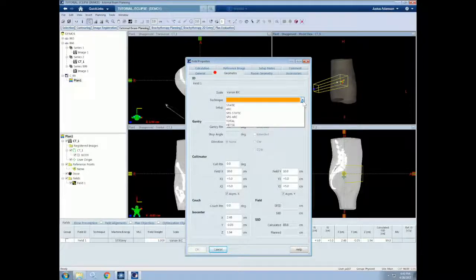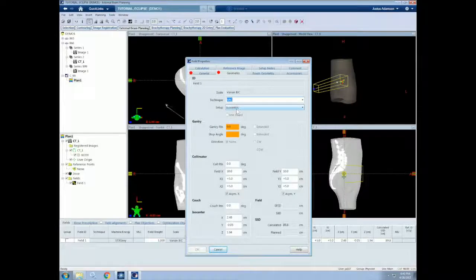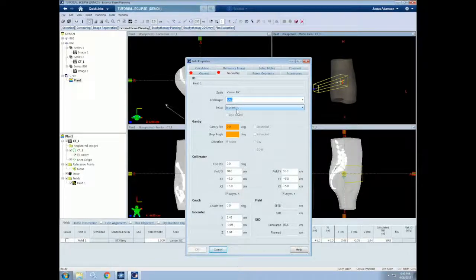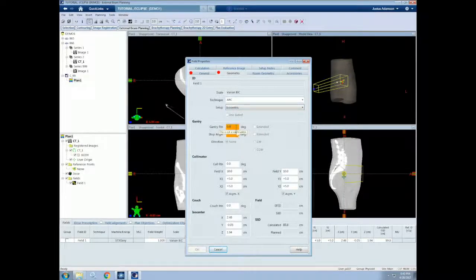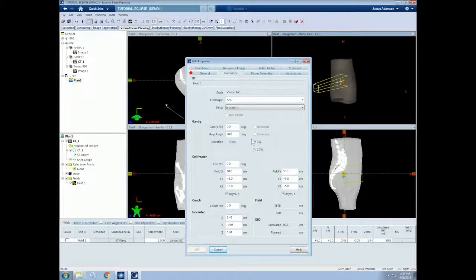Let's choose an arc technique since it requires more inputs. With an arc, we must specify the gantry's rotational range. For now, let's do 0 to 180 degrees in a clockwise fashion.